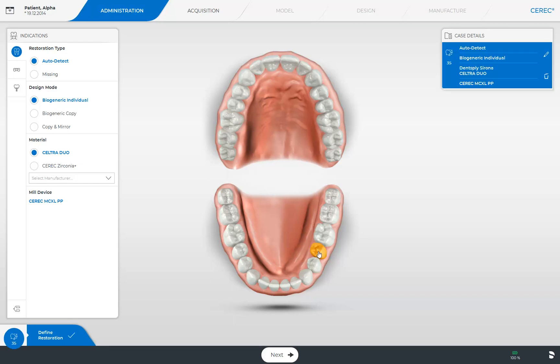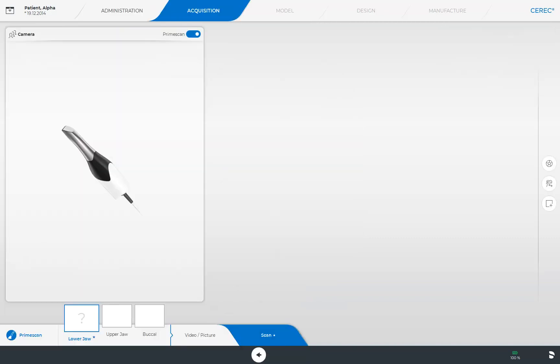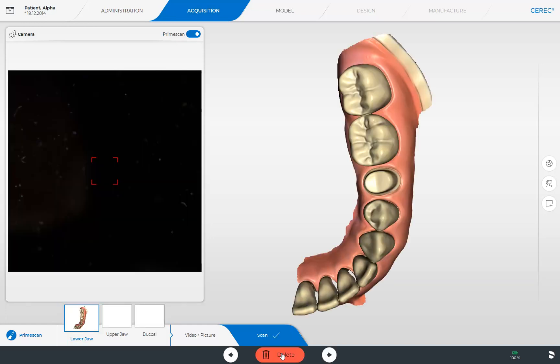Next, we will switch to the acquisition phase by tapping the Next button. In the acquisition phase, we scan our image catalogs. We start with the lower jaw image catalog, and here you can see the quadrant already scanned for our restoration. We switch to the next image catalog and skip the scan process this time too. You will find information about possible scan strategies in our tutorial called Full Arch Scan or Partial Scan with CEREC Prime Scan.